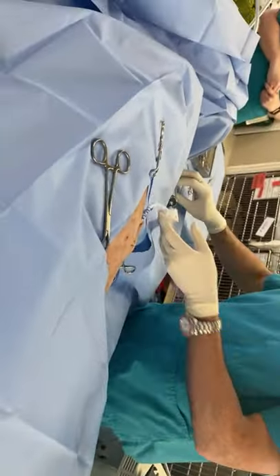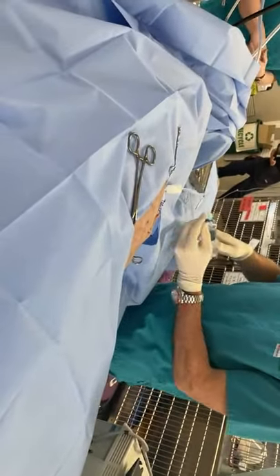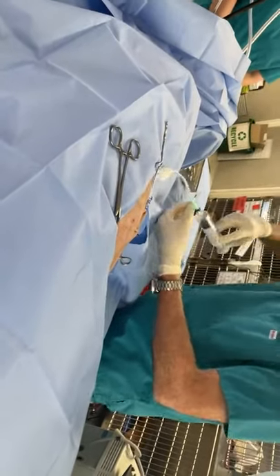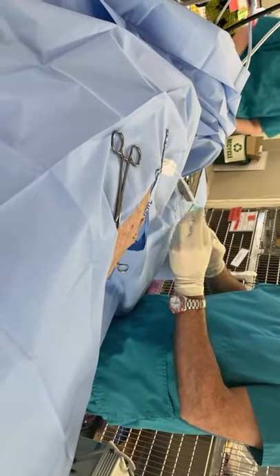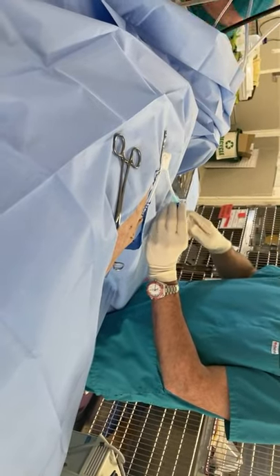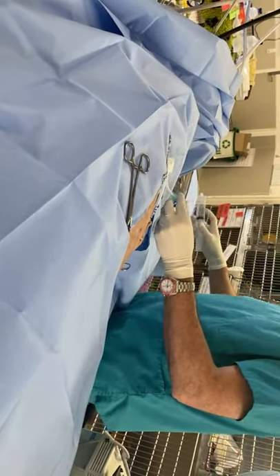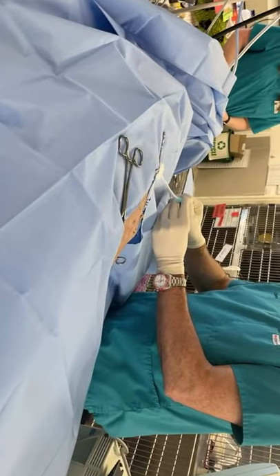I'm going to try one more time to confirm it's negative. I had it briefly open to atmosphere, but the chest is negative now. Injecting another 50 mls of air in and aspirating back — we get back the same 50, so we're confident we've got a good chest tube and that the chest is negative.